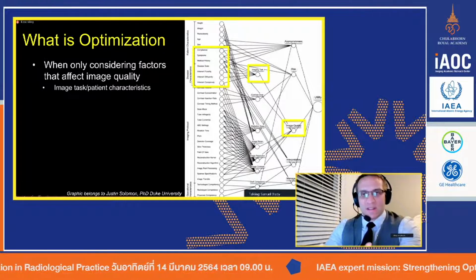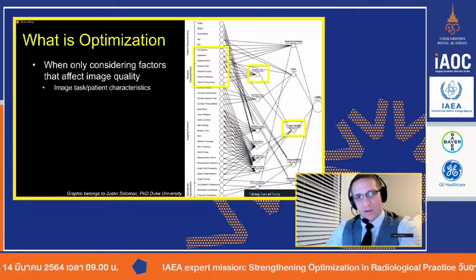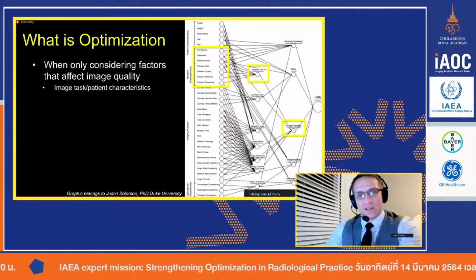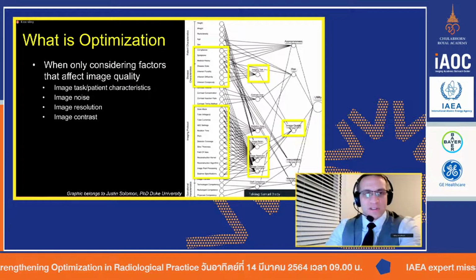What is it that we are trying to image? There's always a reason that a CT is ordered. And so what is the answer, or hopefully the question, that we can get, so we can pass that on to our physician colleagues.